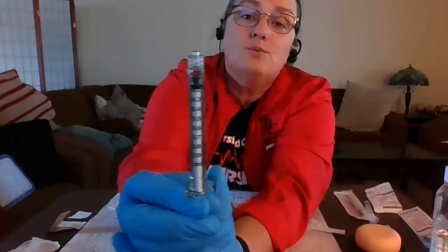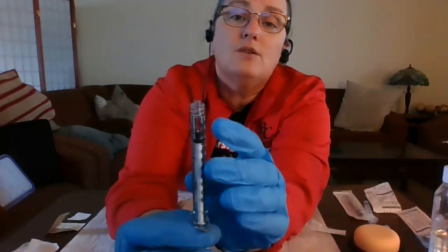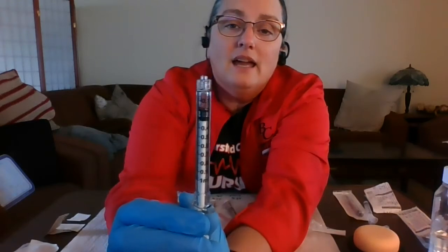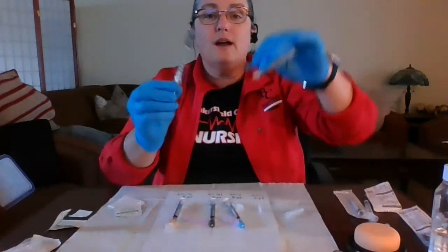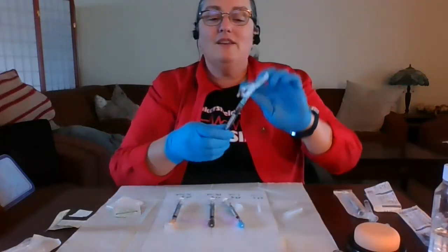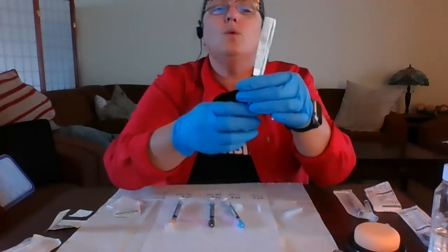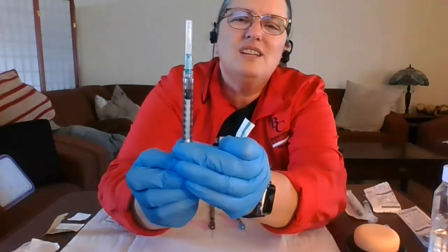So when we are drawing our medication to the correct dose, we pull the top of this plunger down to the marking, and that's our correct dose. Now we have to put a needle on the end of this. If I were to pull it down to my correct dose and then put my needle on and then fill my needle with the medication, we call that dead space, because not everything comes right out of the needle. So we want to bring the correct dose down just a bit.